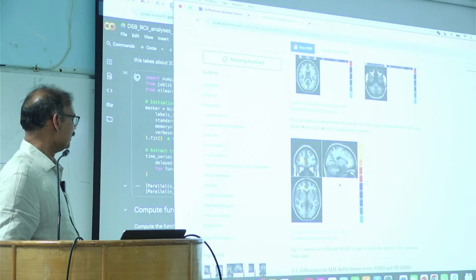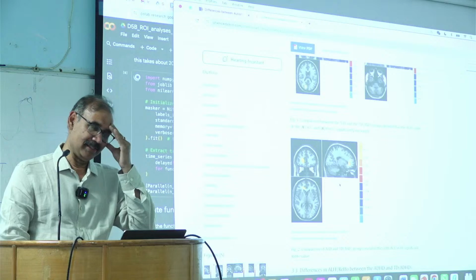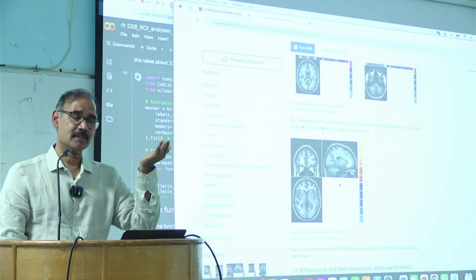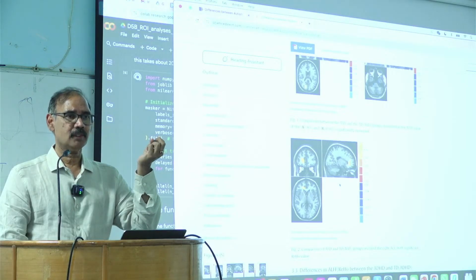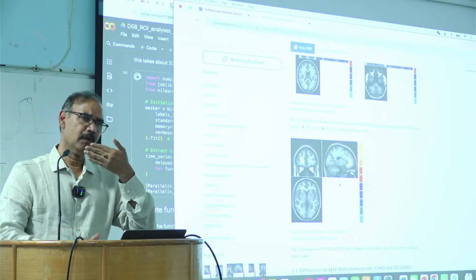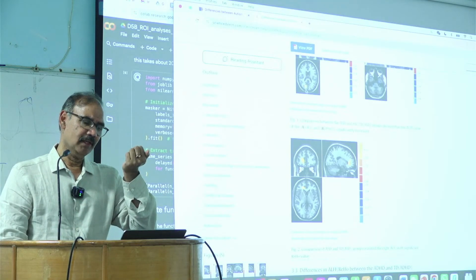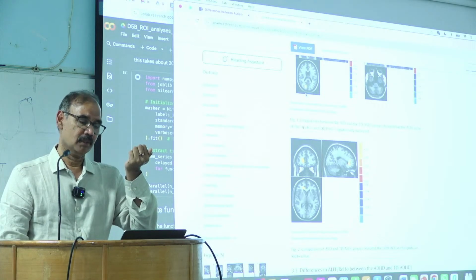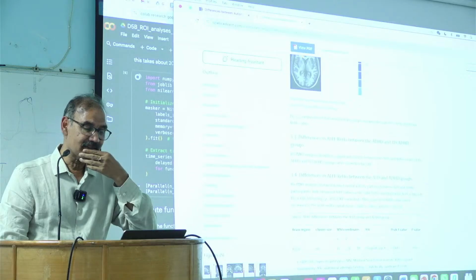One thing I would suggest is that it may be easier to do it voxel-wise, right? Do ALFF for every voxel in the brain and then do a t-test and then see whether this region shows up. I think that is how they did. Let's see how they did.